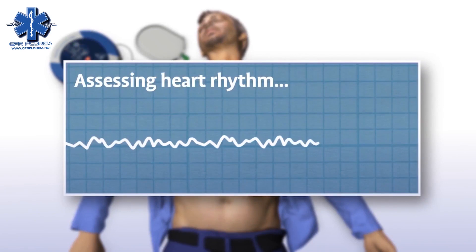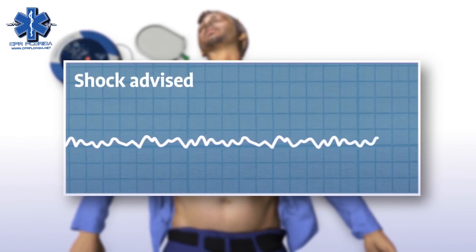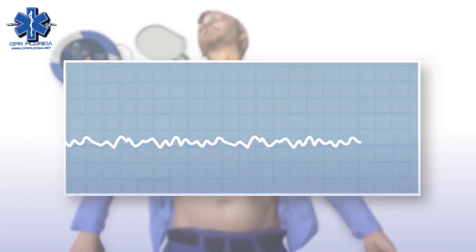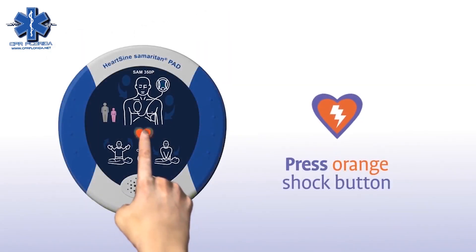The Samaritan PAD automatically assesses the patient's heart rhythm and recommends whether or not a shock should be delivered. When shock is advised, stand clear of the patient and press the orange shock button now. Shock delivered.